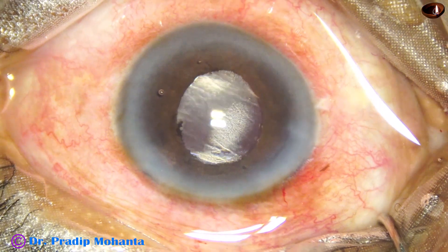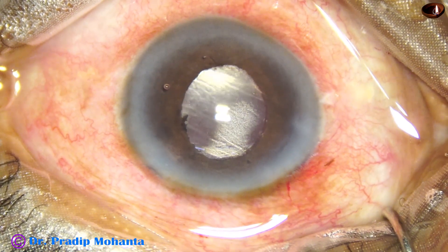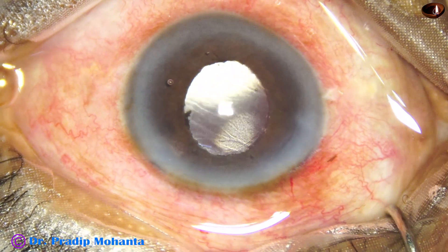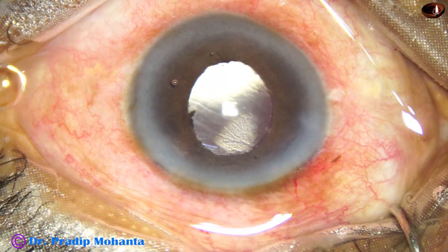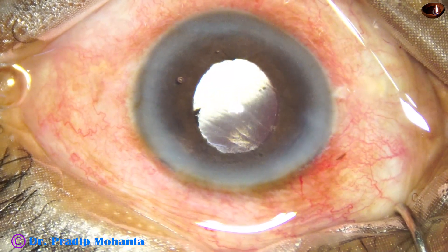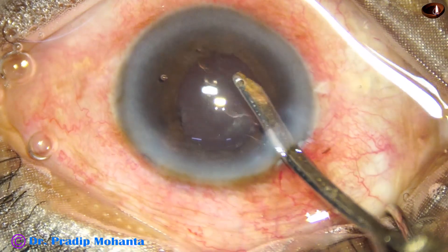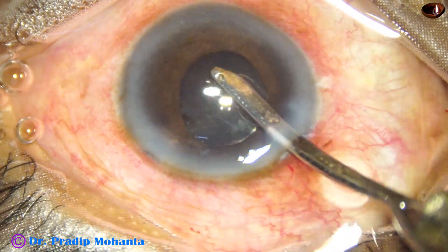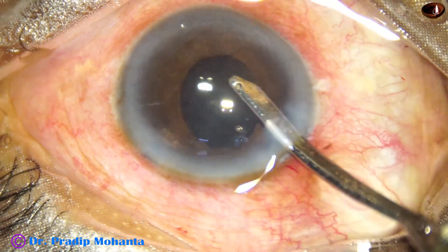The B-hex has been removed using the 23G B-hex forceps. Any flange that is above the iris is held, pulled centrally, and then moved peripherally so that all the flanges are disengaged and come into the anterior chamber. Then we gently hold it and pull it out.